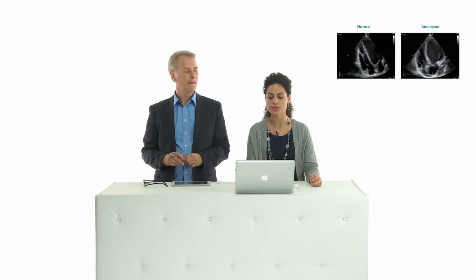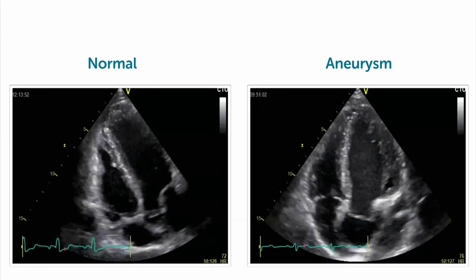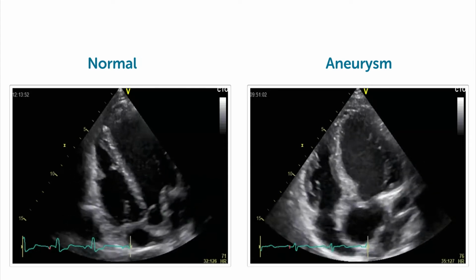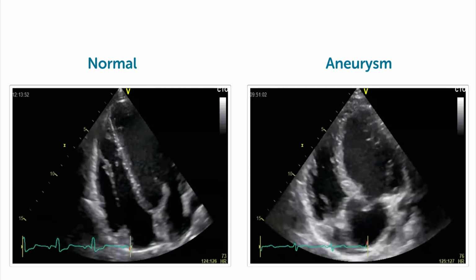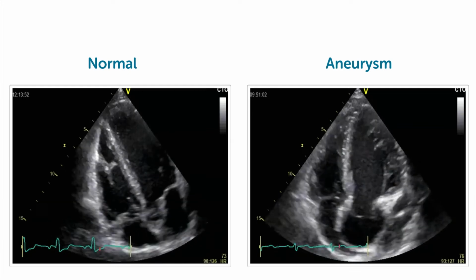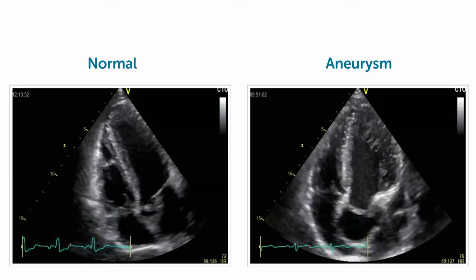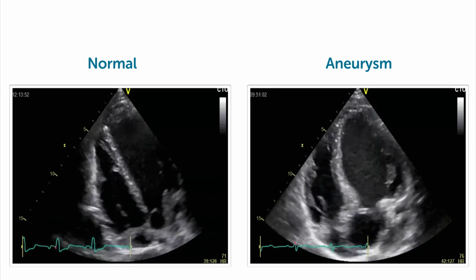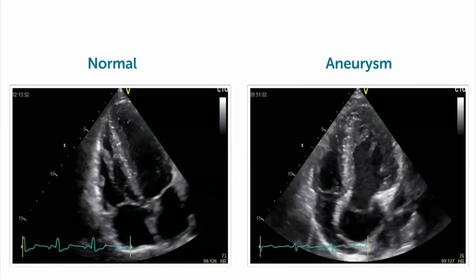But the parasternal view is not the only one to see the aortic vessel and valve. We can also use the 5-chamber view. Here it's not good to measure because the aortic vessel actually is coming towards us, so we are not cutting it orthogonal but somehow diagonal. And this is also the reason why we cannot distinguish the wall of the ascending aorta, but still we can recognize and differentiate a normal aorta and an aneurysmatic one.